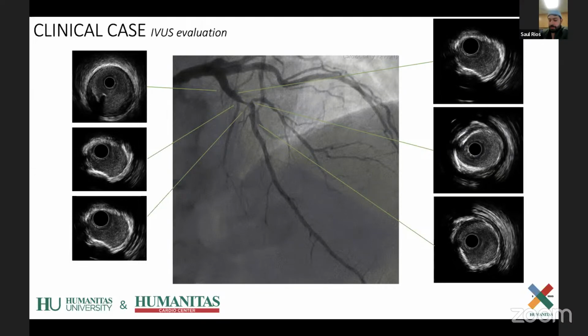And it's kind of difficult to tell the thickness of calcium with IVUS, right? Because the sound doesn't go through the calcification as opposed to OCT. Yeah, that's a good comment that Saul makes. I think it's very difficult to say thickness of calcium. I think IVUS is very good at detecting calcium, showing the length, whether it's superficial versus deep, but thickness is challenging.